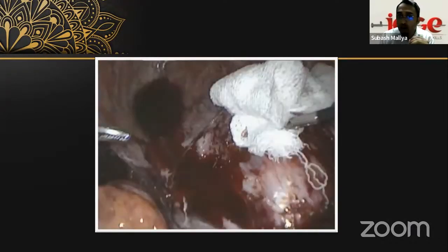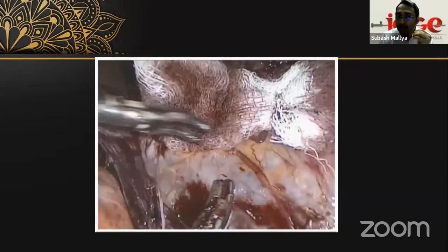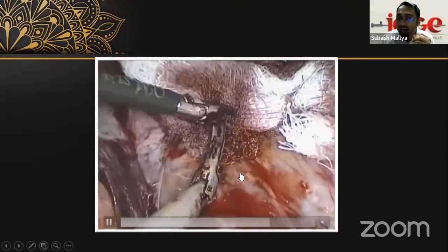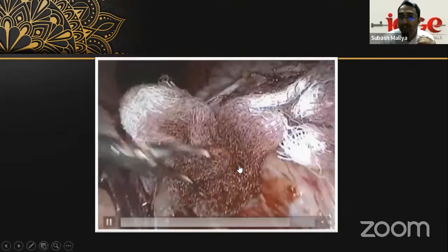Of course, you can coagulate, but make sure to use the left hand. You can see here, you're pushing the gauze piece. You've seen the vein over here. You can see a small vein, as Dr. Pandit had shown. Can you see this vein here? This is a very, very clean area. What you saw over here was a very clean area. You can coagulate without any problem here, because you've pushed down the bladder enough, you don't have to worry here. Again, the fat is over here, which gives a good end.